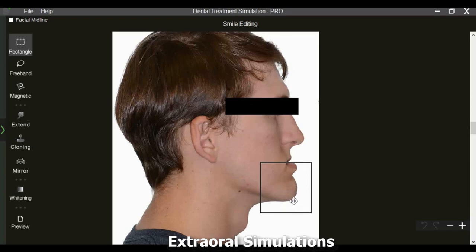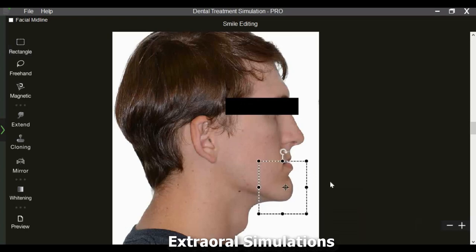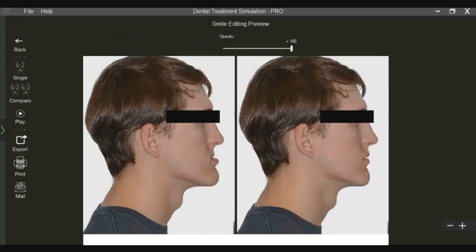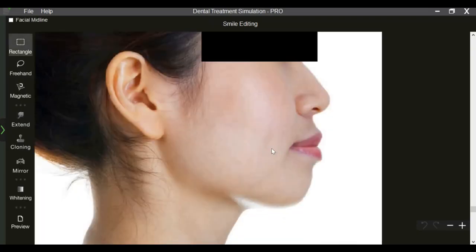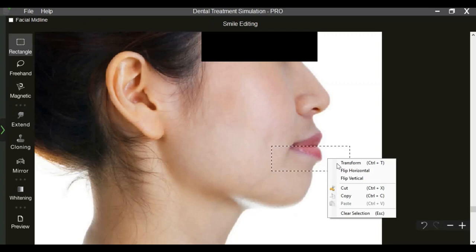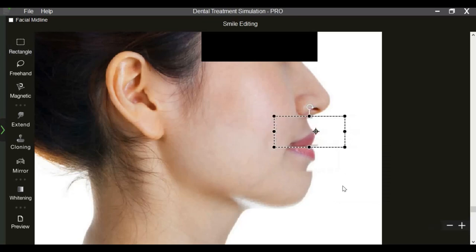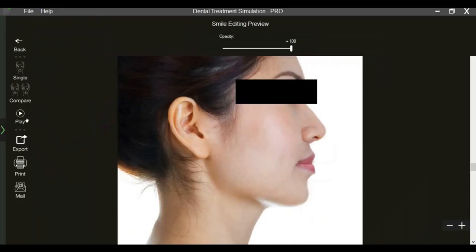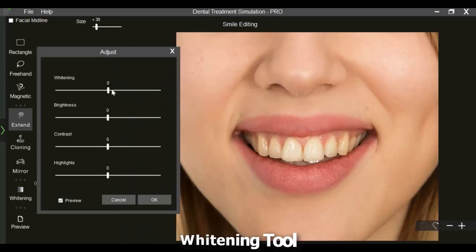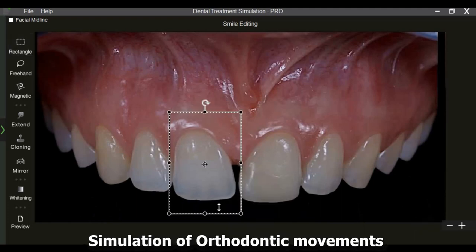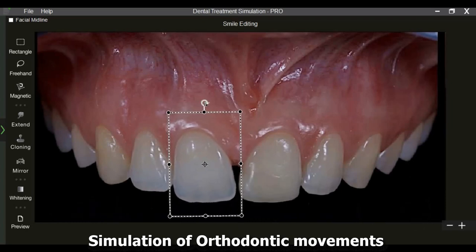Extra-oral changes include simulating jaw movements after orthognathic surgery. Changes in lip position following orthodontic treatment can be simulated using DTS Pro. The whitening tool can be used to simulate dental bleaching to predetermined shades. DTS Pro has built-in templates for different bracket types. Orthodontic movements including intrusion, extrusion, rotation, or bodily movements can be simulated using selection and transformation tools.